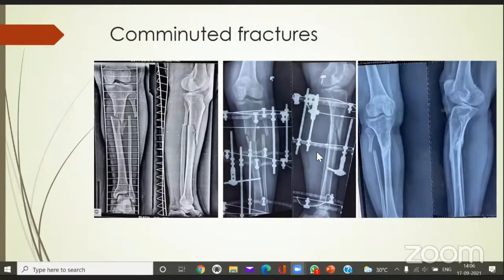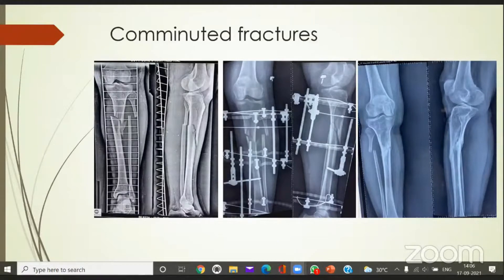Like you see in this case, this is to demonstrate that you have two closer rings and then you have a distal ring because the intact segment is already there. You have a big bone segment that is intact, so you don't need to add stability in that corner.